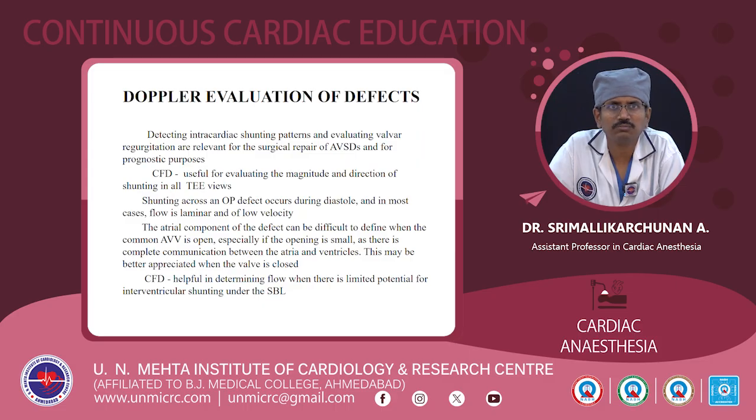Shunting across an ostium primum defect occurs during diastole, and in most cases flow is laminar and of low velocity. The atrial component of the defect can be difficult to define when the common atrioventricular valve is open, especially if the opening is small, as there is complete communication between the atrium and ventricles. This may be better appreciated when the valve is closed.